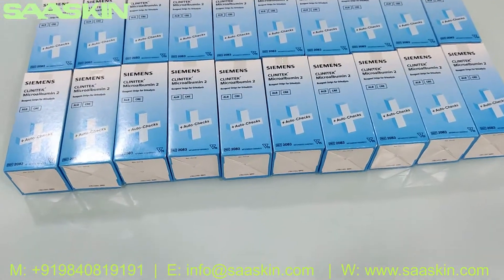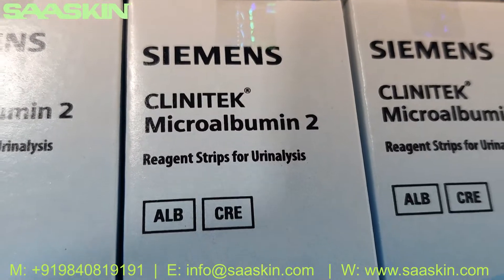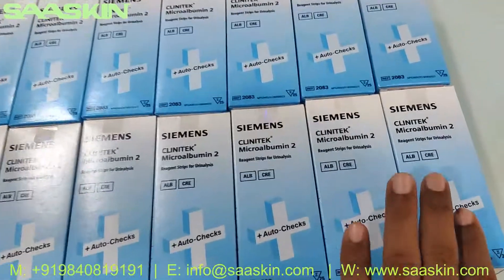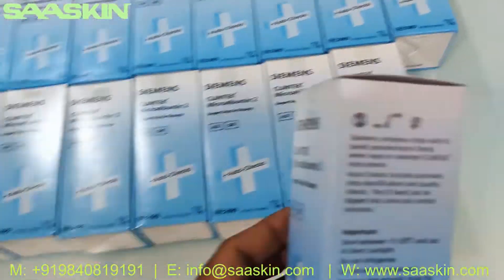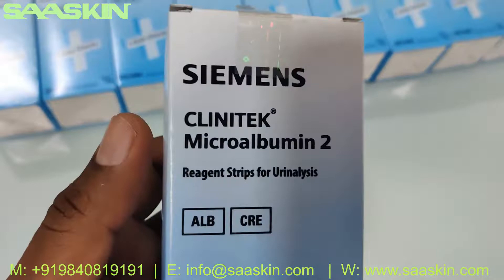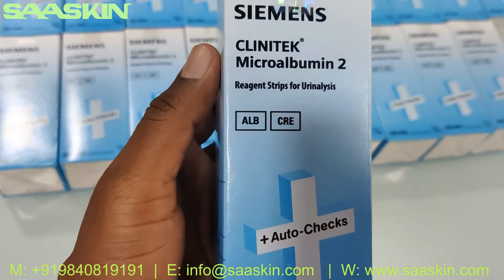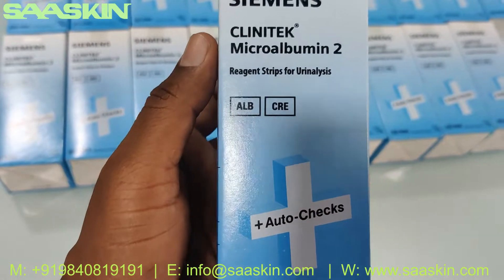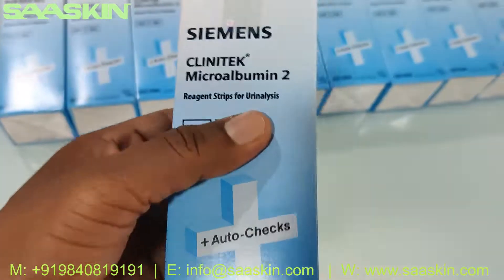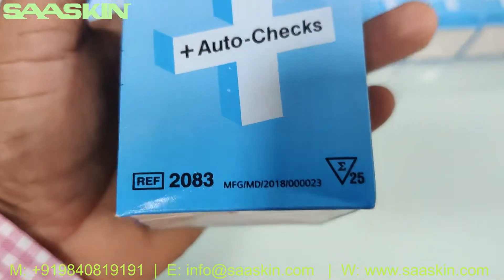Hello everybody, today we're going to see the unboxing of Siemens Clinitek microalbumin urine analysis strips. This is how the box looks like. It is Siemens Clinitek microalbumin strips for urine analysis. This is basically used in the Clinitek's urine analysis machine.